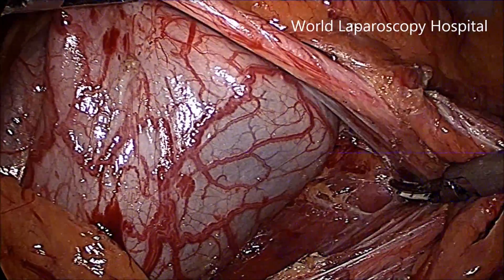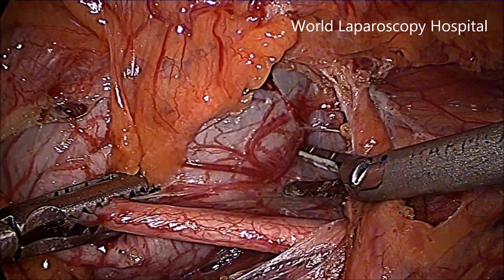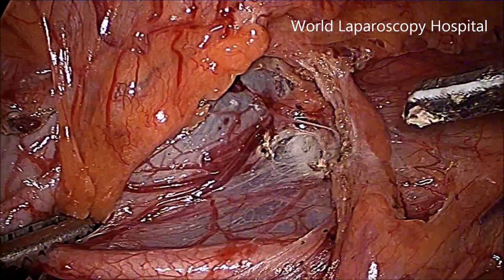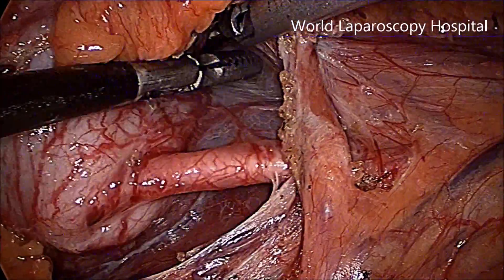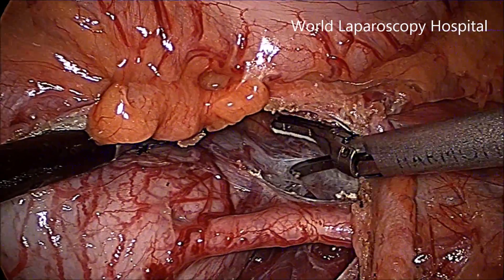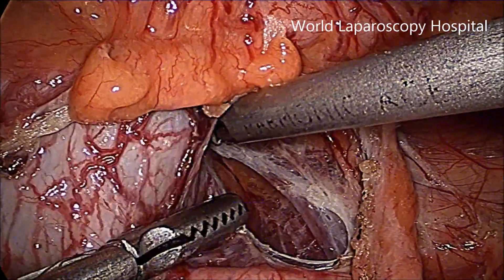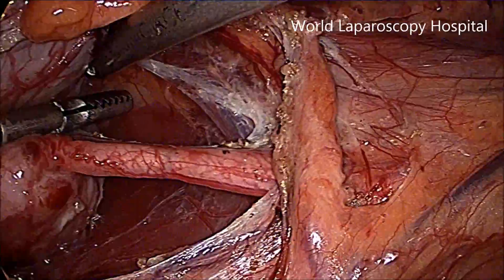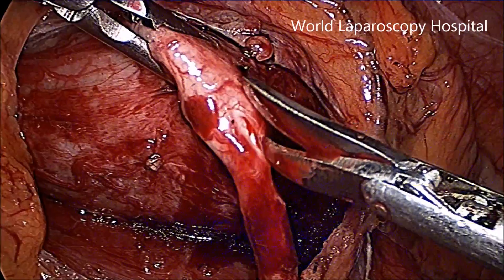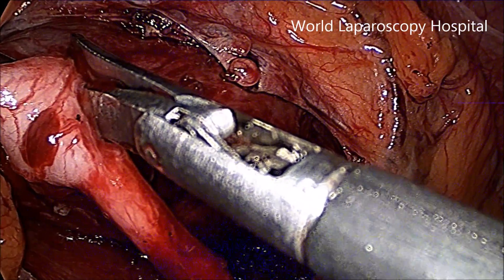Now the ureter is nicely skeletonized for a couple of centimeters from the pelvis. It is important that all around the boundaries of the pelvis should be completely adhesion-free.